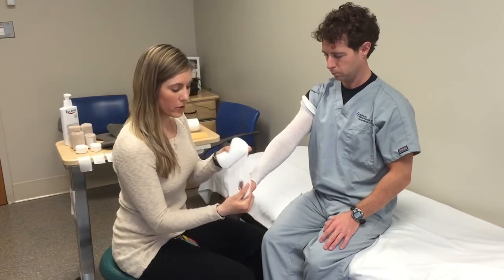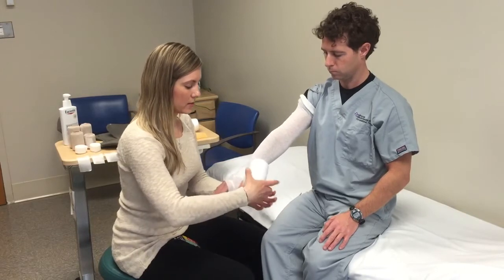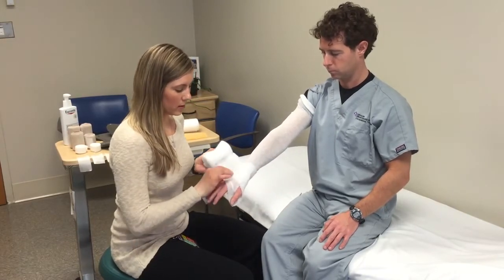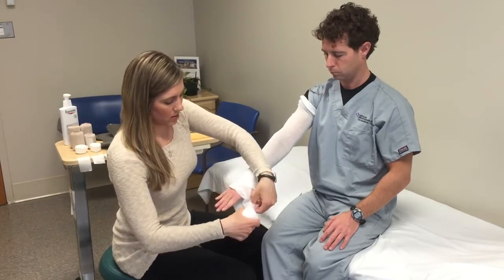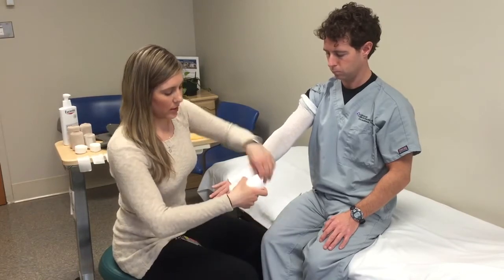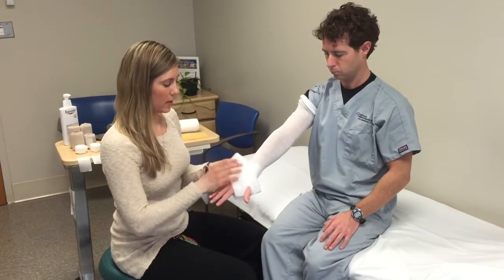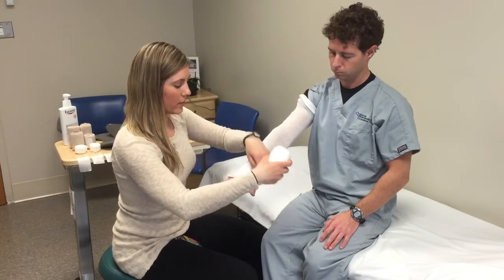Put a hole for the thumb and then go around the hand and wrist. It's usually good to double up around the hand to protect the bony areas of the wrist and hand. Now you can spiral up the arm.